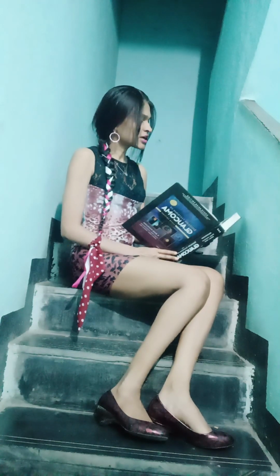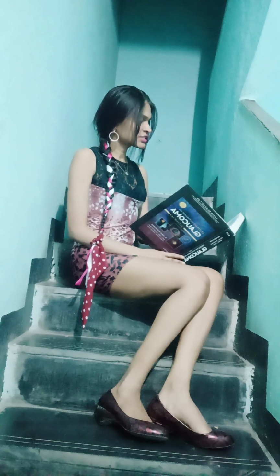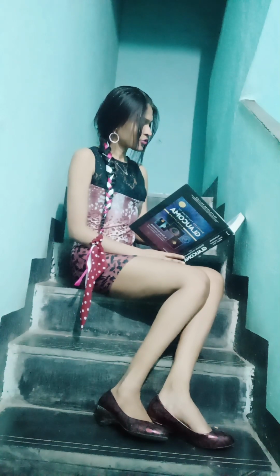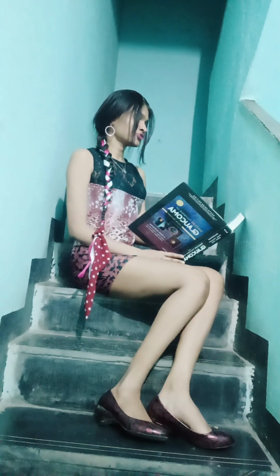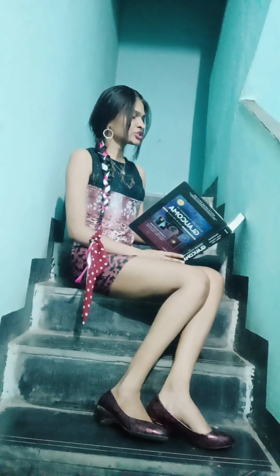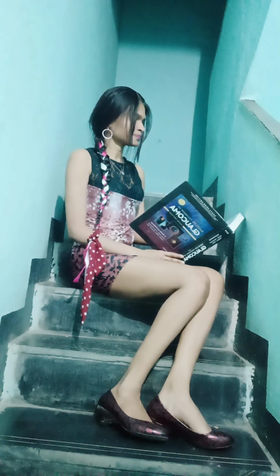When I exceeds the critical angle, the light is reflected back into the first medium. The critical angle for the cornea-air interface is approximately 46 degrees. Light rays coming from the anterior chamber angle exceed this critical angle and are therefore reflected back into the anterior chamber, preventing direct visualization of the angle.